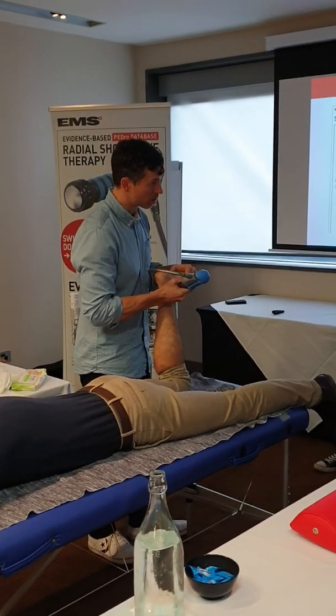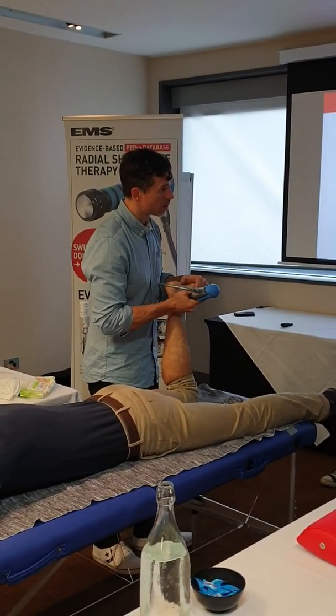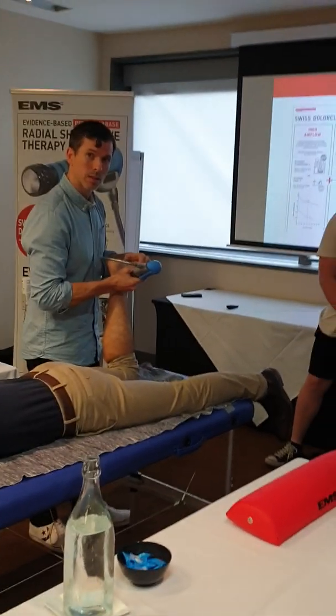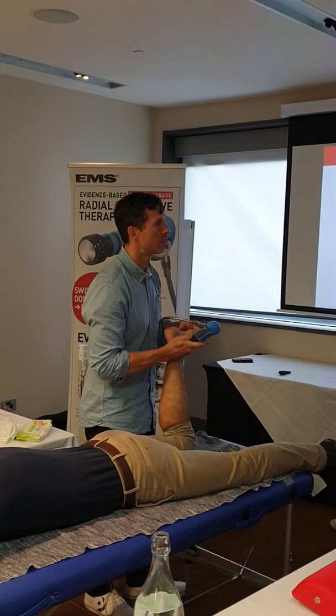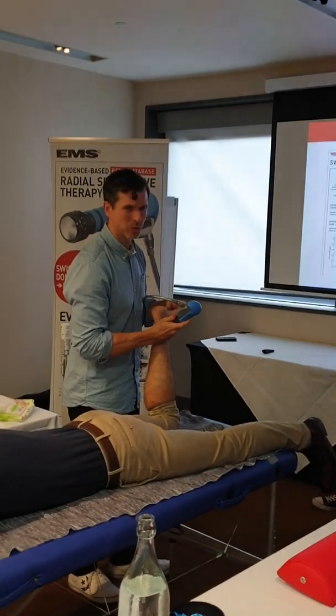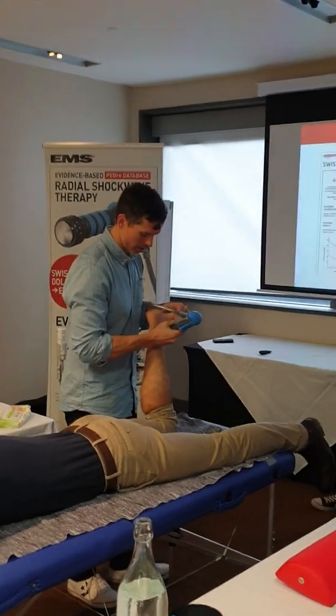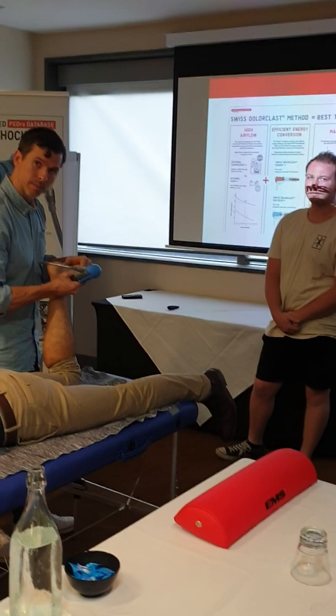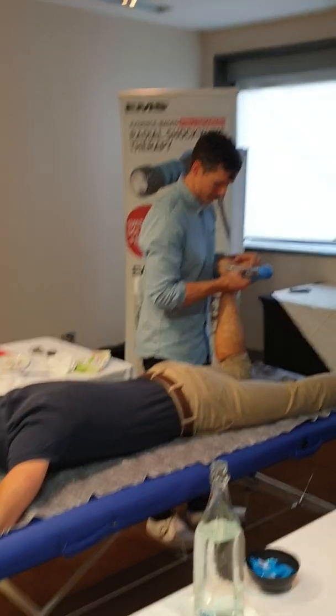I know if you were putting the head through the autoclave periodically, if you wanted to. You can put the tips through, yes. Not the handle itself, just the tips. Do you have to take the O-rings out? Yeah, if you have an autoclave, you can autoclave the silver bit inside and the rings come off. I'll pop by and give you guys an insert.